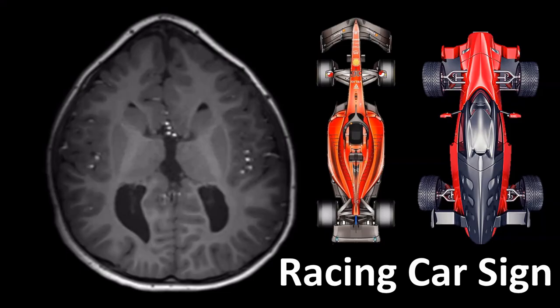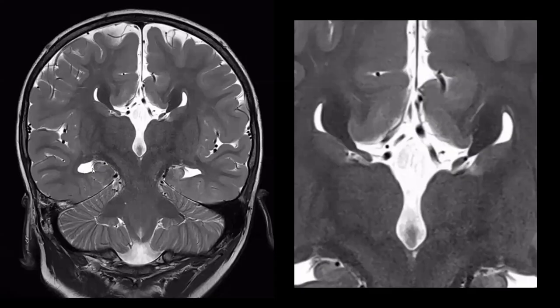In the axial plane, we get what is called the racing car sign. The third ventricle is the body of the car, and the frontal horns together with the trigone and posterior horns of the lateral ventricles correspond to the wheels. If you look at that configuration, you can recognize a racing car.